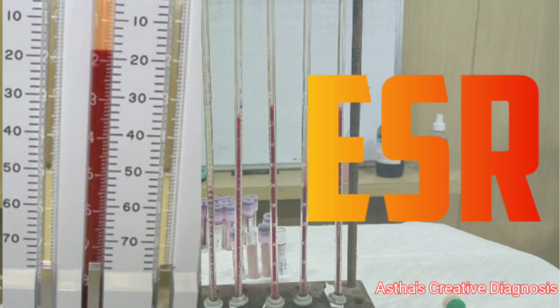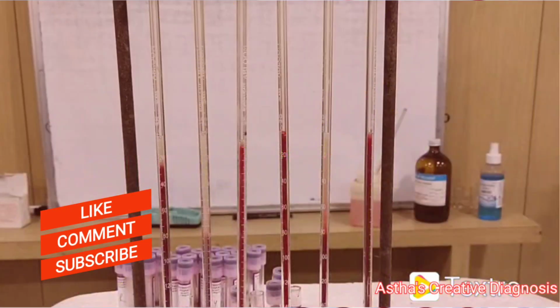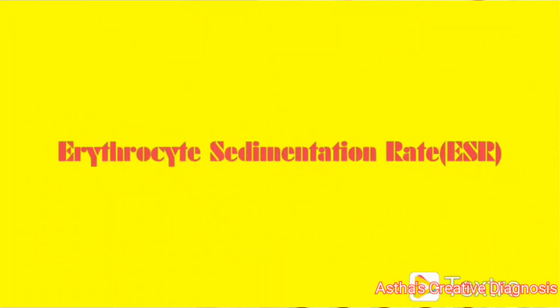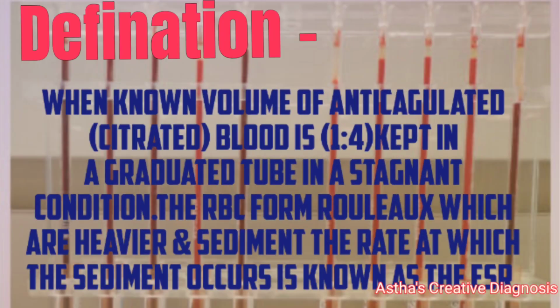Hello friends, our today's topic is erythrocyte sedimentation rate, that means ESR. Definition: when a known volume of anticoagulated, that means citrated, blood at 1:4 dilution is kept in a graduated tube in a stagnant condition, the RBCs form rouleaux, which are heavier and sediment. The rate at which the sedimentation occurs is known as the ESR.